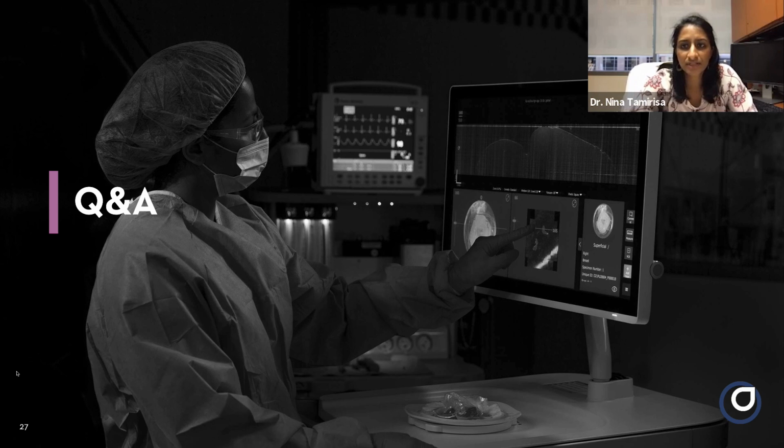Another question here was, assuming you get clear margins using OCT, would radiation therapy still be required or necessary? I think that would depend on what the final pathology showed. We know there's a subset of people who may be able to omit radiation with favorable DCIS or even invasive cancer, depending on the tumor characteristics, age, and things like that. So it would all eventually depend on your final pathology. But OCT would certainly help to at least establish that negative margin.